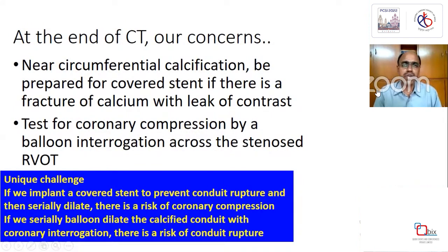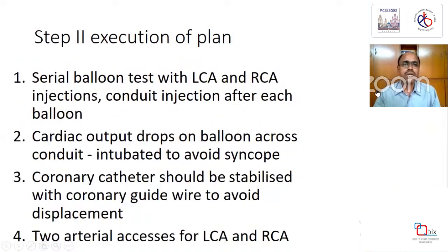There is a unique challenge. If we implant a covered stent and expand it, there is a possibility that we may compromise the coronaries. But if we serially balloon dilate to check for coronary artery patency, there is a small chance of conduit rupture. So we decided to use rather compliant balloons and check the conduit for coronary compression.